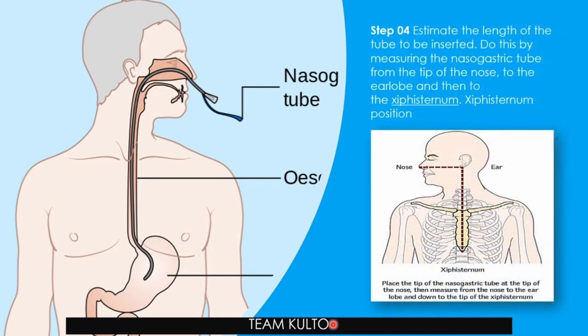Step number four, estimate the length of the tube to be inserted. Now, how are you gonna do this, nurses? Yung mga landmark mo ha, tatlo. Tip of the nose, and ito tandaan mo, chronological din to, ma'am. Kailangan umpisa mo siya sa nose, and then saka magpo-proceed to the earlobe, and then to the xiphoid process. Ito, tandaan mo yung screenshot mo na.